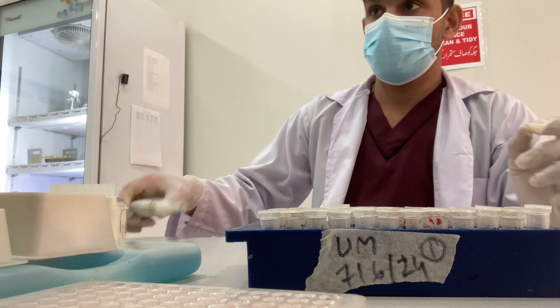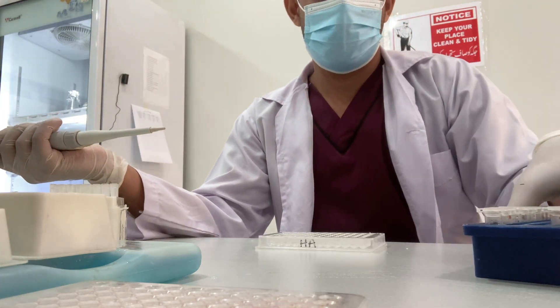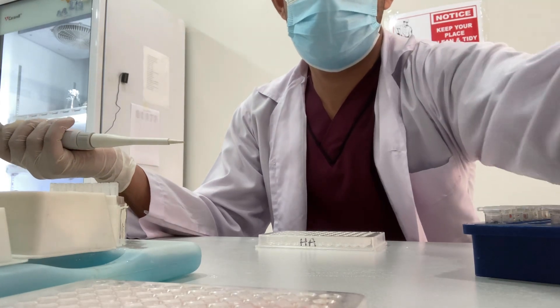Now we are moving toward the next step, which is to add 25 µl of serum in each column from A onward.